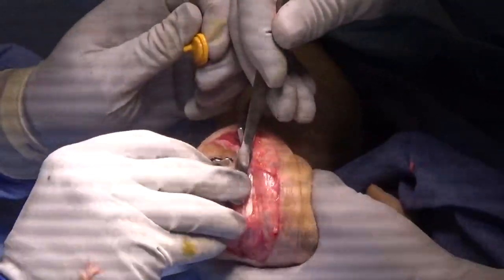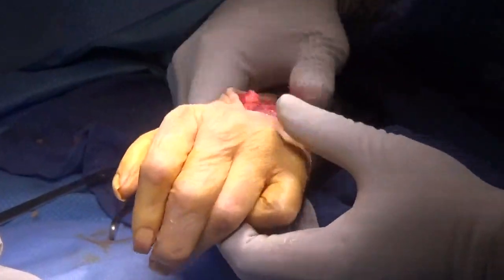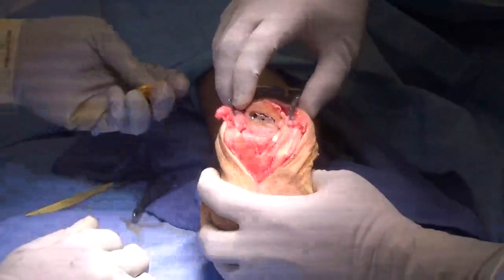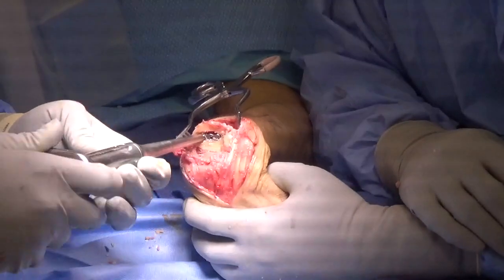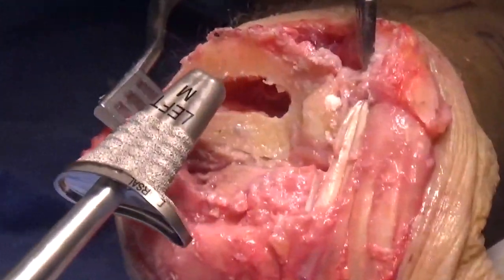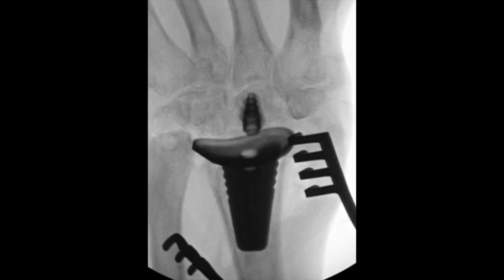Our trials are now being placed. And now I think we have a very satisfactory range of motion to the wrist with the trial components. The radial trial is being removed. And now the size medium radial component is being impacted in place. Fluoroscopic views show ideal position.